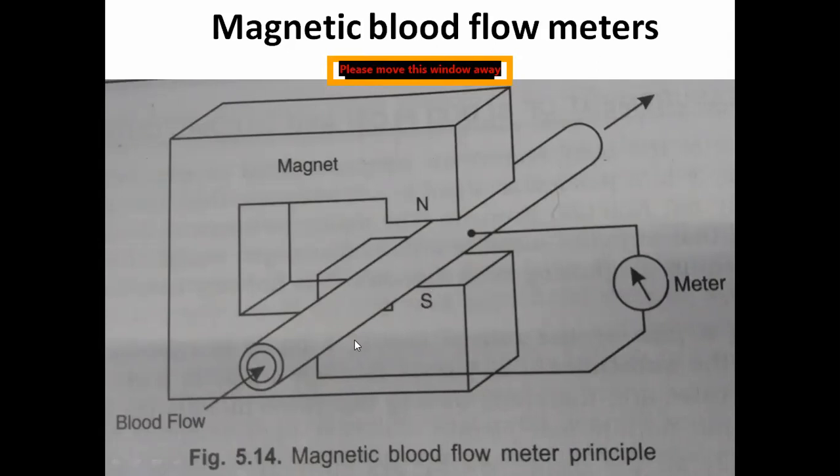When we use an electromagnet in place of a magnet, we have to use a wire wound around the magnetic core. Whenever we apply the input signal to this core, it will produce magnetic flux according to the applied signal, and that will be reflected in the received signal, or induced voltage.